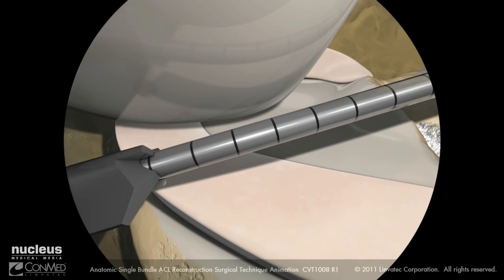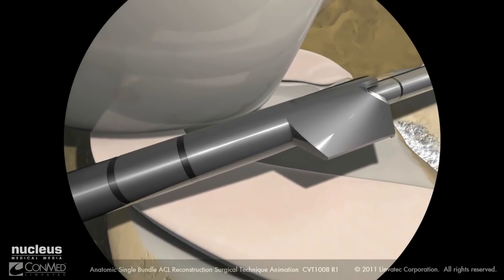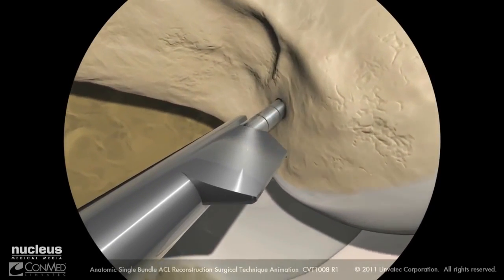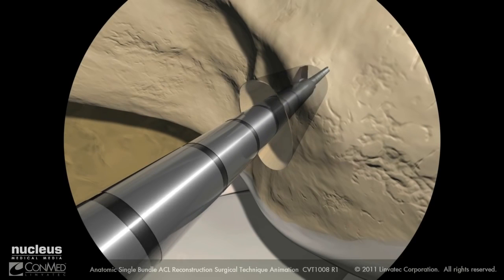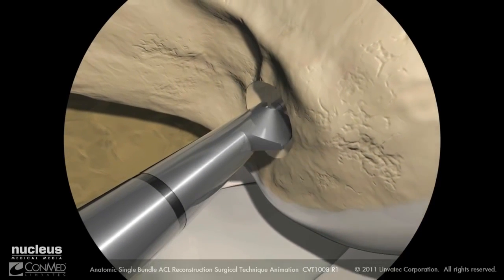Insert the monofluted sentinel drill bit over the guide pin through the accessory anteromedial portal with the cutting edge facing away from the femoral condyle and advance the drill bit to the femoral ACL footprint. Using a piston-like back-and-forth motion, advance the sentinel drill bit to the desired depth, cautiously to prevent blowout of the lateral femoral cortex. Pull the drill bit back slowly until the blade is visible in the joint space.